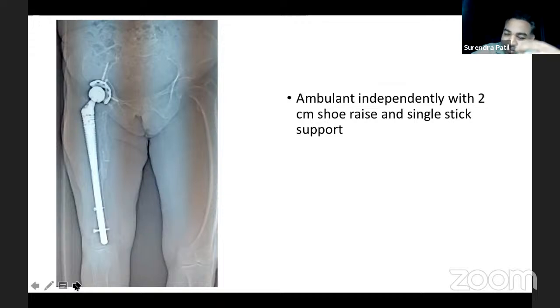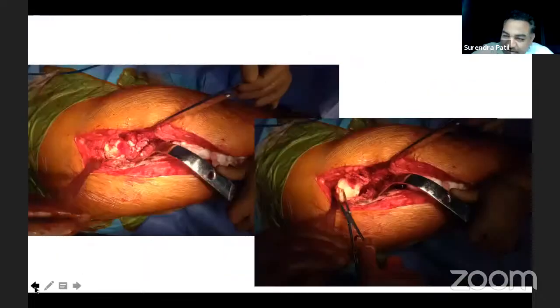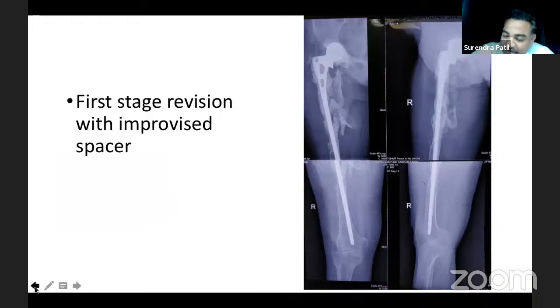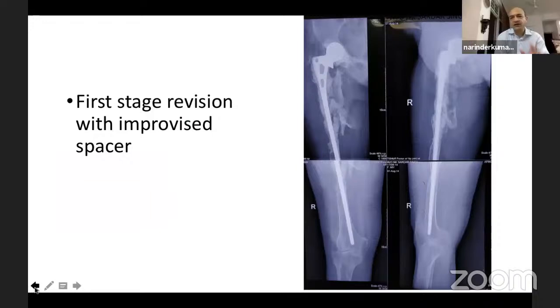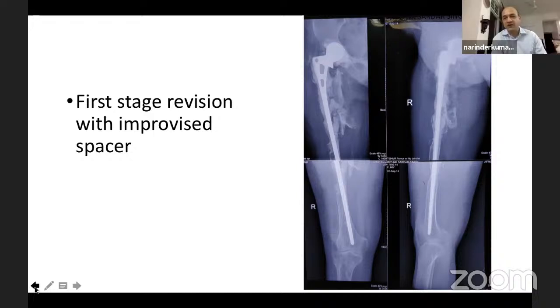It's a dislocated one. You put a cement layer in the acetabulum as well, and after that you reduce the femoral head. At the spacer stage, you put a cement mantle in the acetabulum. Yes, I always do that. I put it at a doughy stage, and then I reduce the head into it, and then I mold the whole cement mantle on the rim of the acetabulum. So it doesn't go in the hole. The cement can go into the pelvis if you have a medial wall defect. This is what I had published basically, specifically how to put in a spacer with a medial wall defect.